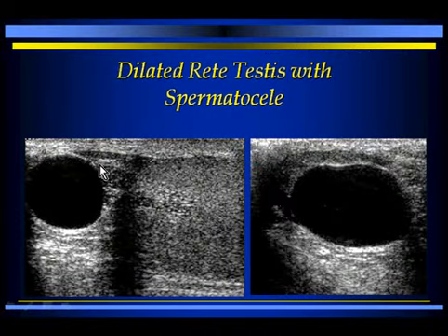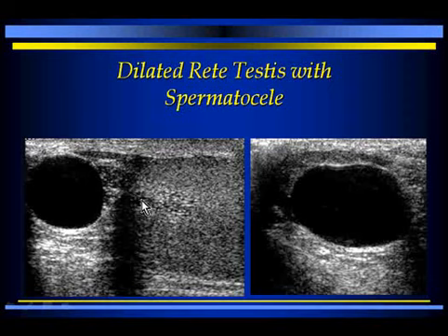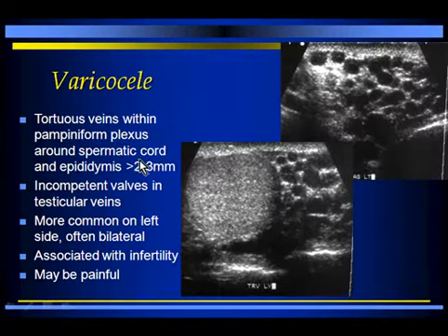Again, here is your spermatocele. Spermatocele, another view. And this is the same patient. Here's the mediastinum testis, and there's a slightly dilated rete testis, which sort of makes the mediastinum thicker and more obvious.